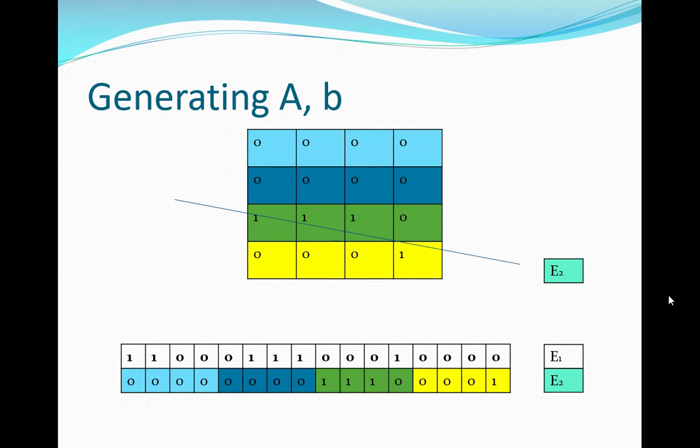Right, so sorry, one more question. Sure. If, for example, a proton gets bent into a different slice in its path? Yes, no, we actually count that. Absolutely. You can enter one slice and go out another. It's actually very common. About 96 to 98% of the protons can go between 1 to 5 slices, because the slices are vertical. But it means it'll go like the first 2, and then these ones, it'll still be in that path line, but these 2 could be in one slice and those 2 could be in the next. They'll all be together. We do the whole reconstruction in one big fell swoop.